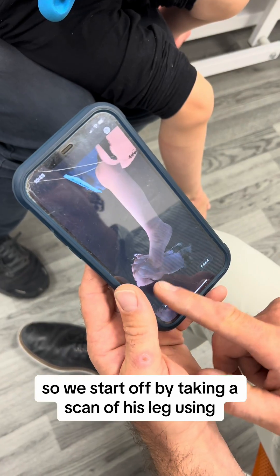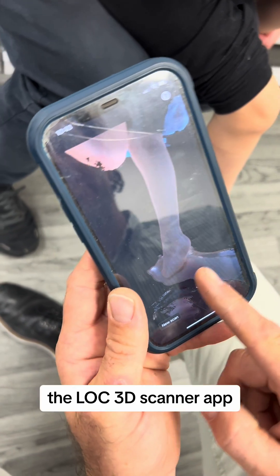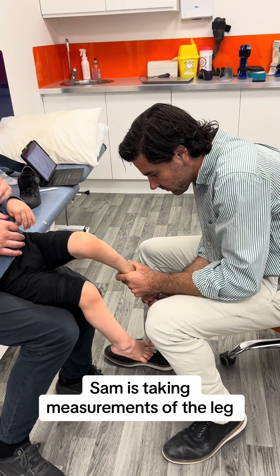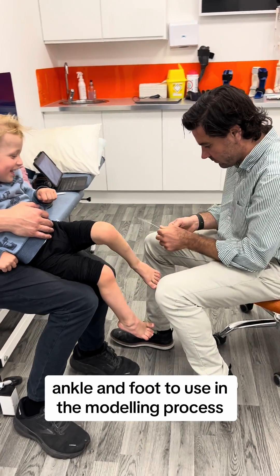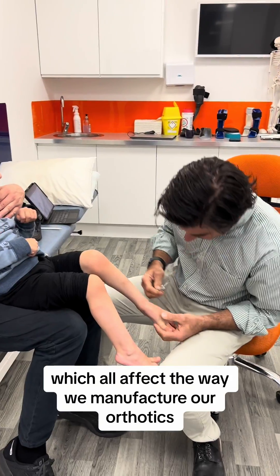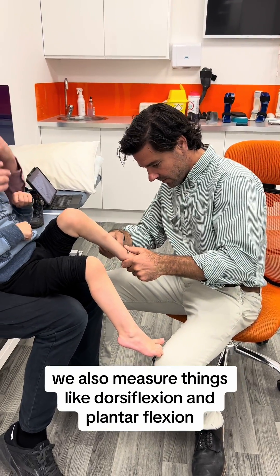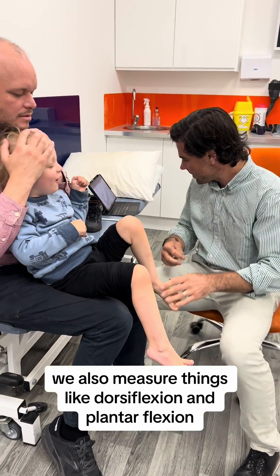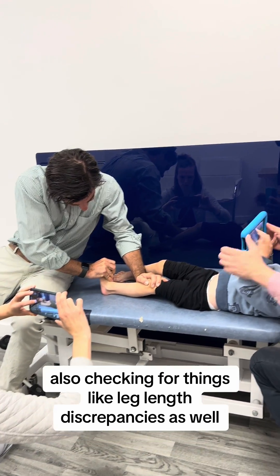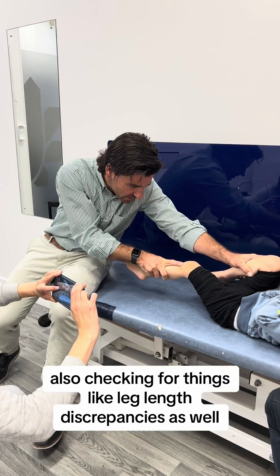We start off by taking a scan of his leg using the LOC 3D scanner app. Our senior orthotist Sam is taking measurements of the leg, ankle and foot to use in the modelling process, as well as things like his height and weight, which all affect the way we manufacture our orthotics. We also measure things like dorsiflexion and plantar flexion — how much movement he has in his ankle — and check for leg length discrepancies as well.